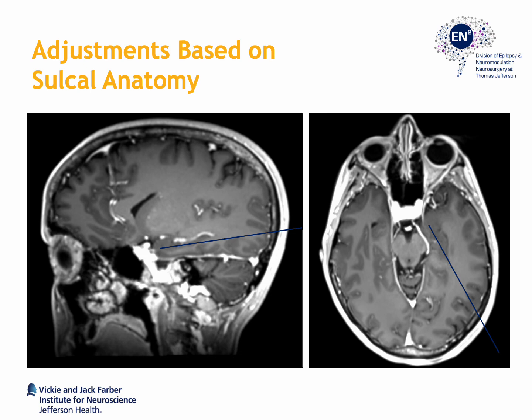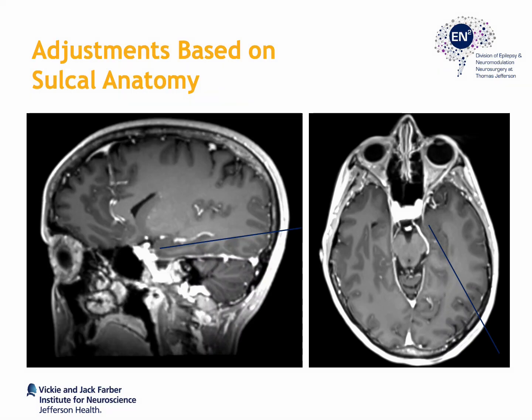Finally, the trajectory is extended back towards the cortical surface, ideally towards the crest of a gyrus. The trajectory is also advanced anteriorly towards the anterior portion of the amygdala to ensure complete ablation of this structure. As these adjustments are being made, the surgeon must keep in mind the three critical points along the trajectory: specifically the level of the hippocampal head, the hippocampal body, as well as the posterior corridor at the level of the tectum.